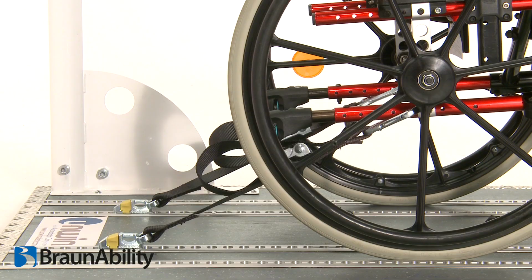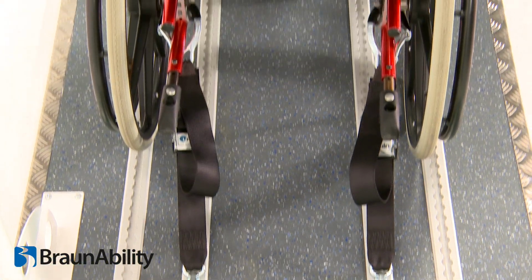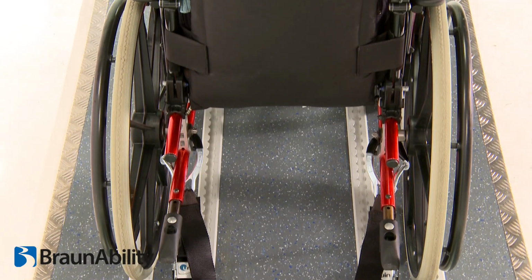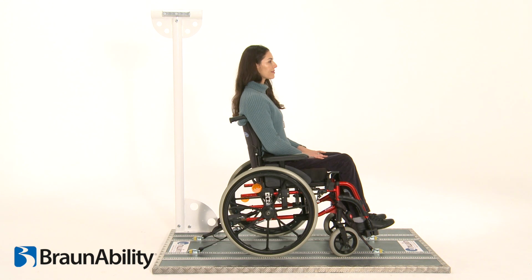The webbing should create an angle of around 30 to 45 degrees and should be in line with the rear of the frame to hold the wheelchair correctly and securely. A suitable occupant restraint must now be fitted. See the relevant occupant restraint video.